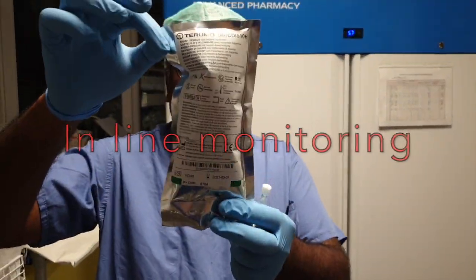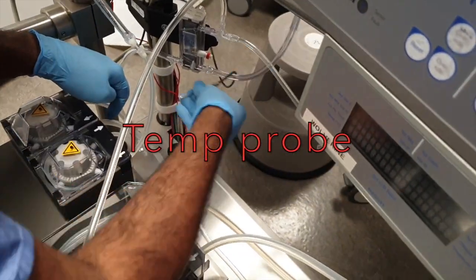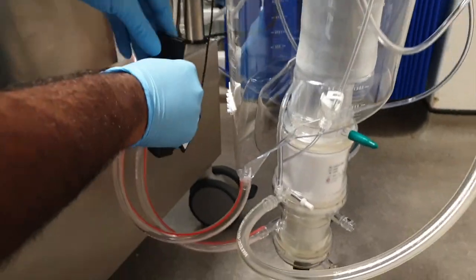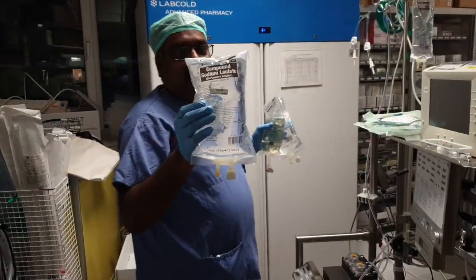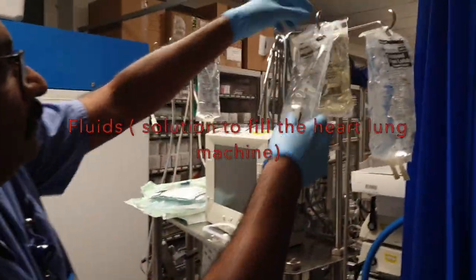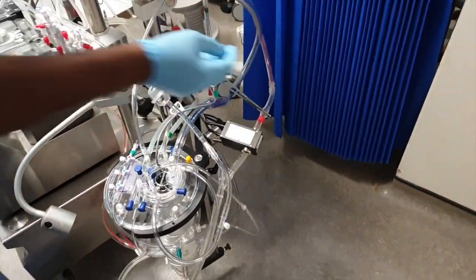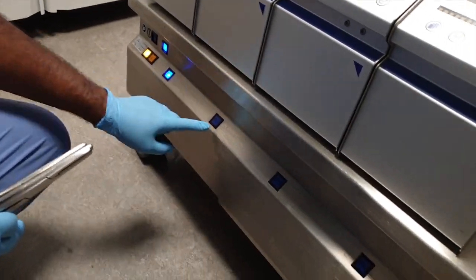In the previous video we saw how we set up the heart-lung machine. In this video we are going to see the importance of priming a cardiopulmonary bypass circuit. To start off, we prime the heart-lung machine with clear fluids during surgery. If the patient's hemoglobin is low, then we will consider adding blood to the circuit.